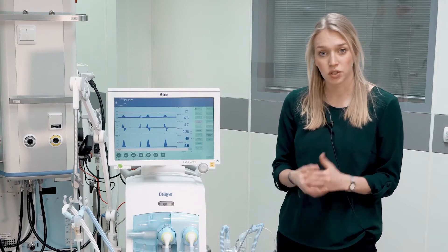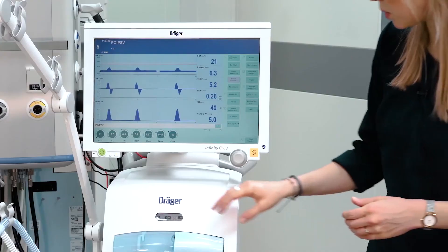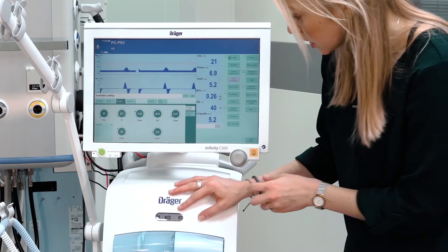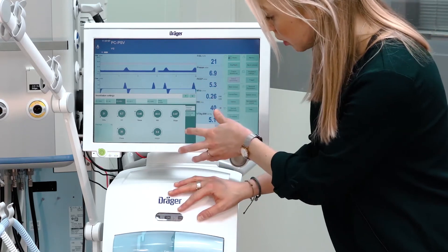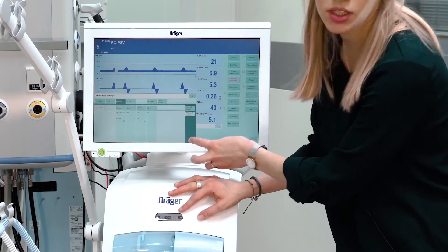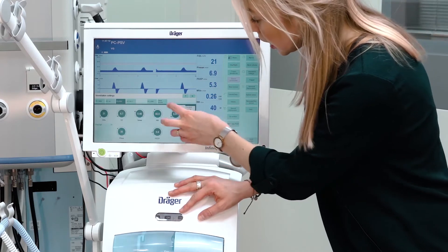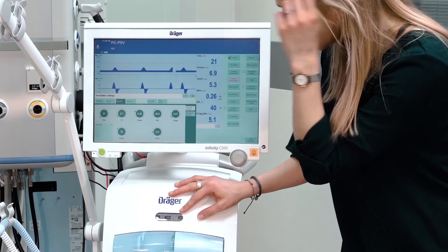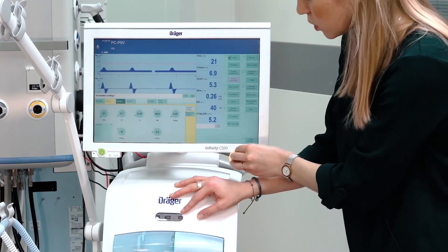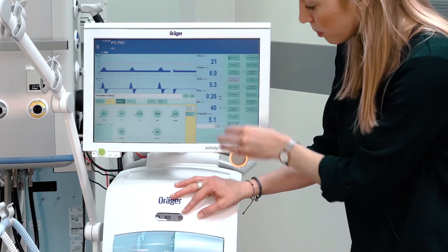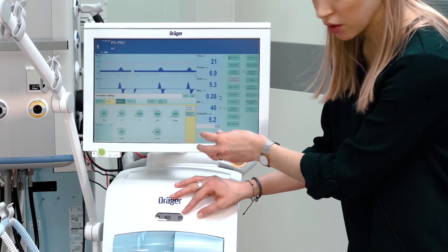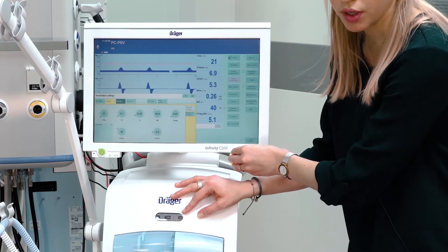If you want to change to a different ventilation mode, you can enter via the arrow the submenu ventilation settings, where you can find your respective parameters and the additional settings of your ventilation mode. If you now want to change to a different ventilation mode, please select the ventilation mode and confirm after making sure that all the settings are correct by pressing the rotary knob.